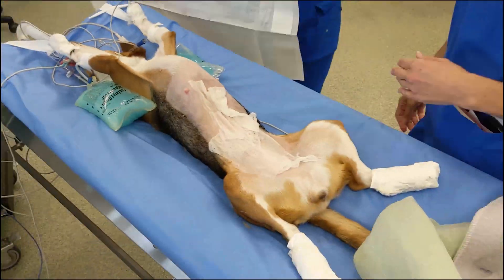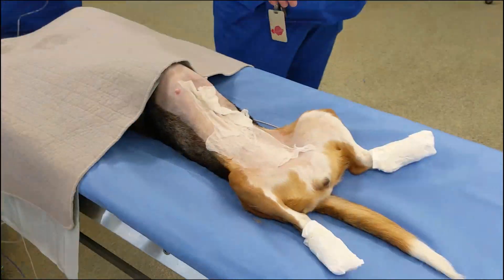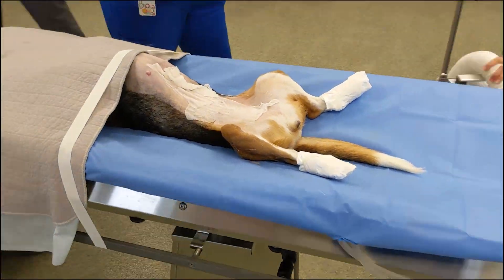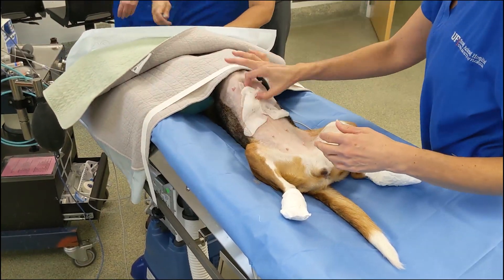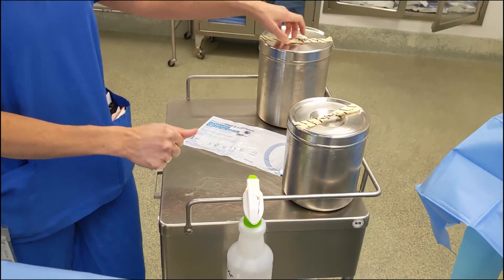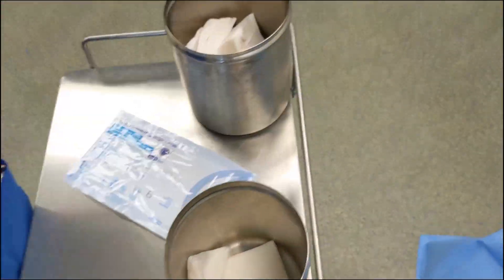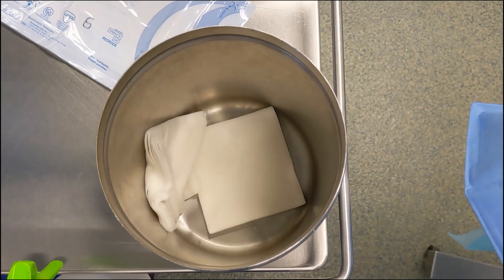The patient is moved to the OR, positioned, fitted with warming devices, and fastened into place. The surgical table is then elevated to the appropriate height for the surgeon, and the transport gauze are removed from the surgical site. Now it's time for your sterile scrub. For your sterile scrub, you'll wear sterile gloves and you have sterile containers with sterile chlorhexidine scrub and sterile alcohol-soaked gauze.